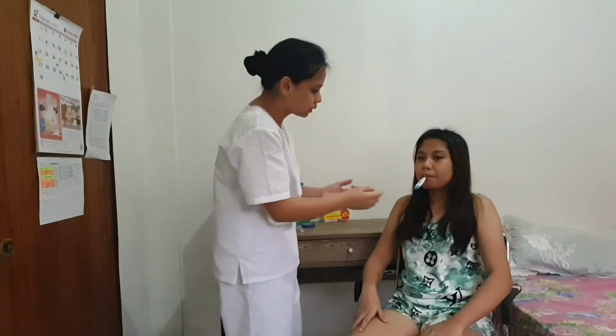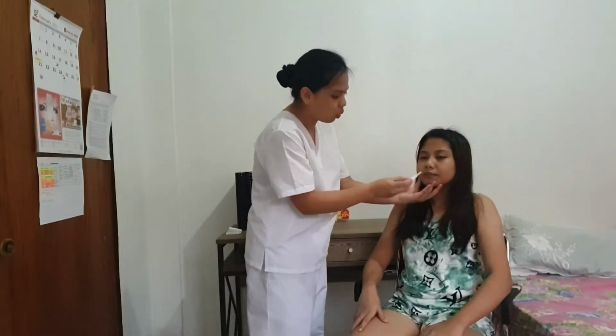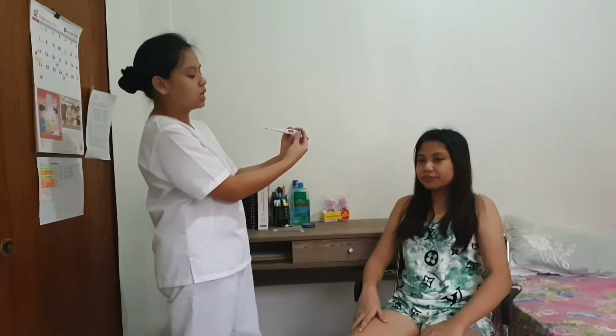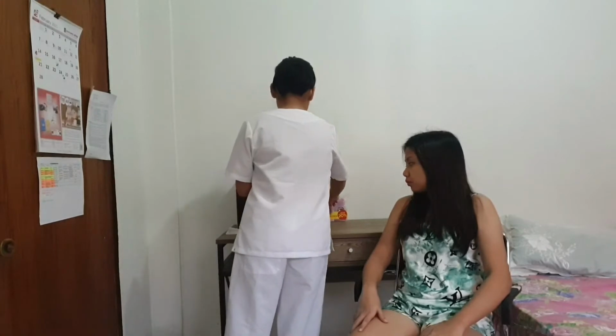Okay, it has finally beeped. Please open your mouth. So I got the patient's temperature. It is 36.2 degrees Celsius. I am going to clean it with an alcohol swab again.